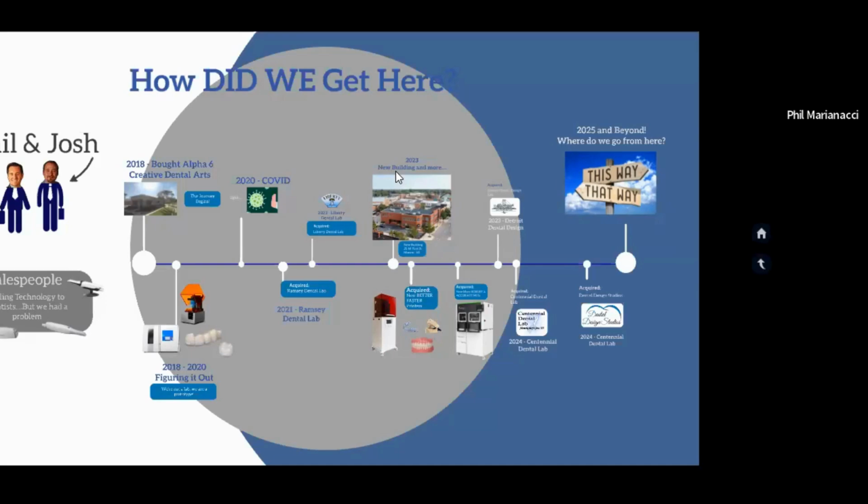And it was the only time that we could do it. And you have the whole family time and everything like that. And getting multiple people all at the same time is nearly impossible. So we started using Nemo Studios to really collaborate and talk, and having it all in one place.